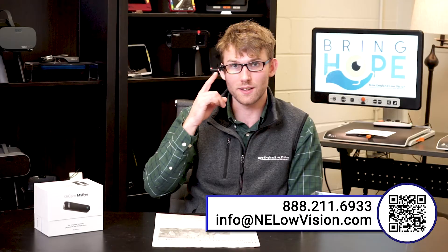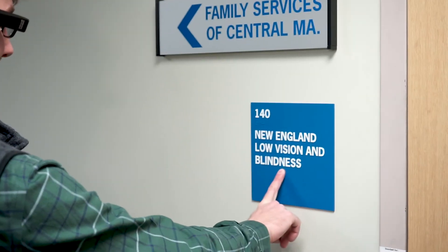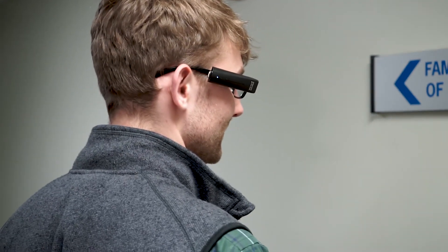The LED lights next to the camera activate automatically in a dark room so you're able to get a good scan of the text. Now I'm going to use the point gesture for reading in a real-life scenario for a short reading task. The device reads: "New England Low Vision and Blindness." Another major feature for reading with the OrCam MyEye is smart reading.